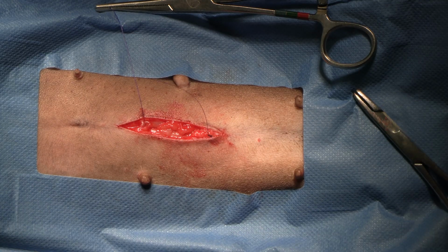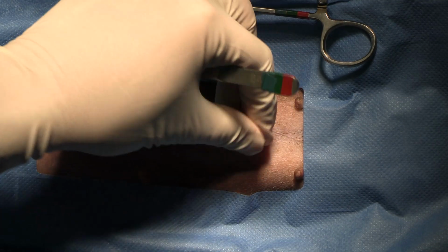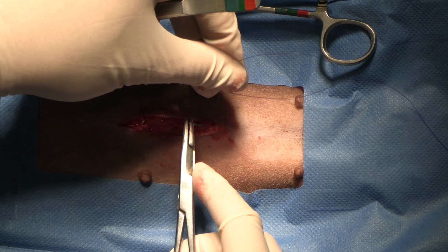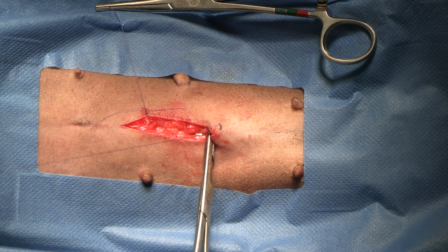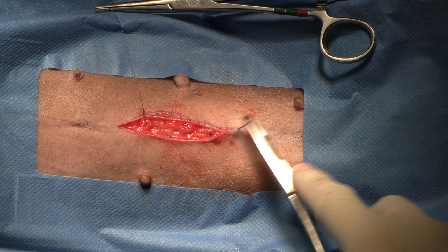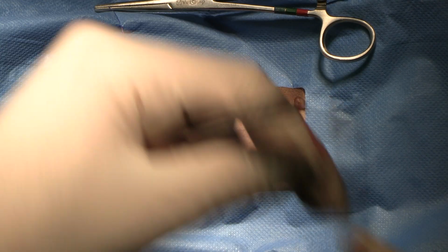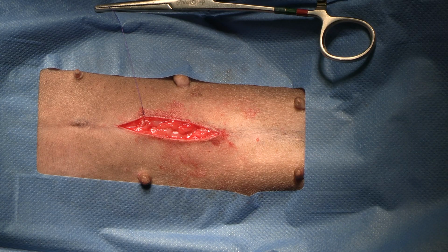Bella, cast and external suture. Frustratingly, I have a knot in my 4-0. Instead of dragging that all the way through. Do you want 2 or 3? Let's go 2-0. 2-0 external nylon. Instead of dragging that all the way through the dermis, I will just change plans.